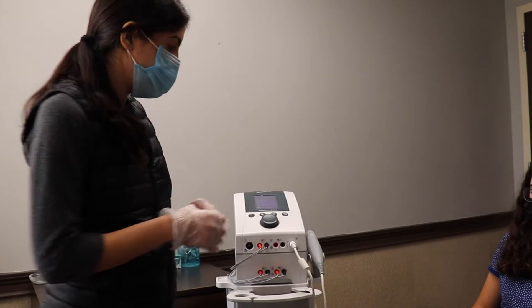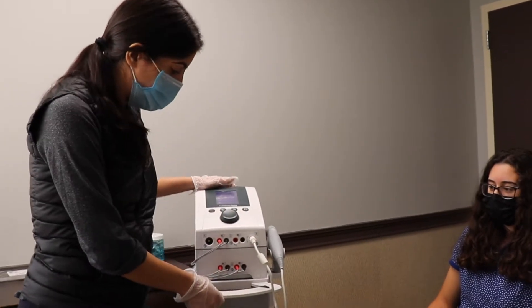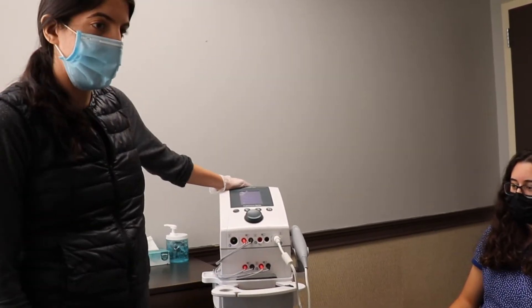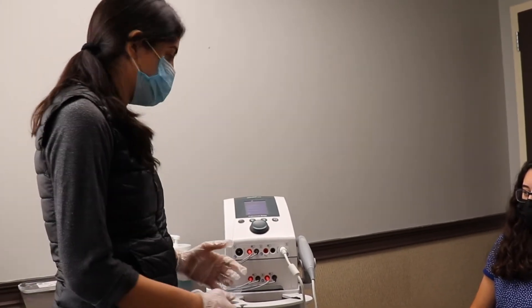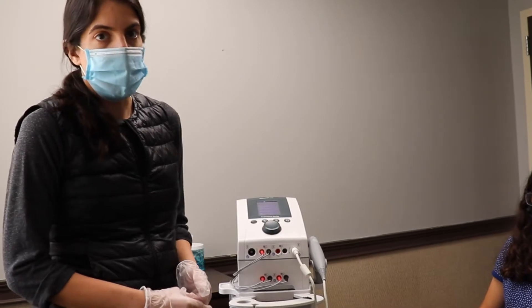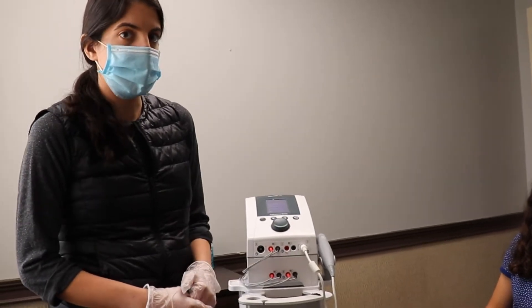We administer ultrasound with this device we have here. This is a combo unit — it's electrical stimulation and ultrasound in one. Today I'm specifically going to talk about ultrasound.